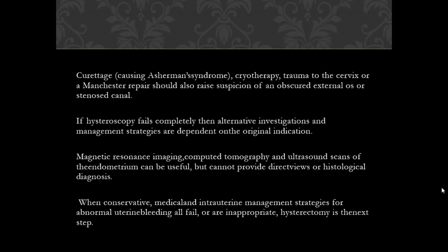What about the media? We didn't discuss the media and how much, which media, monopolar, bipolar. Okay, you mean the electrosurgery? Yes. Suppose we are doing the hysteroscopy, so which media is better to use and how much deficit should we reach before we stop the procedure?